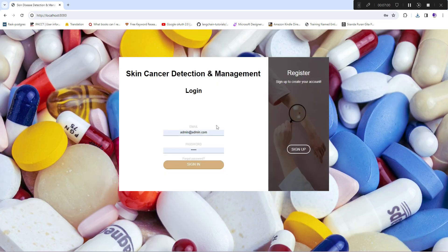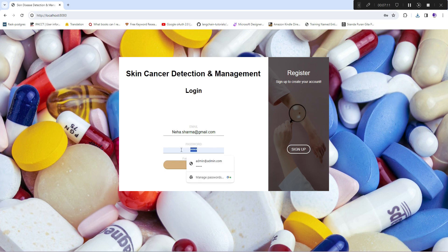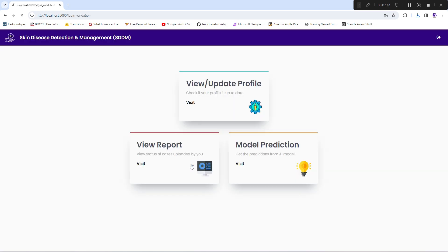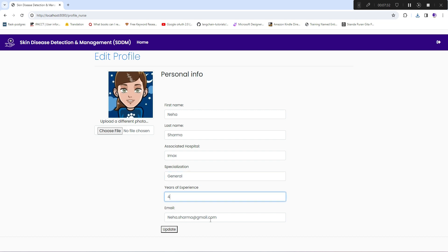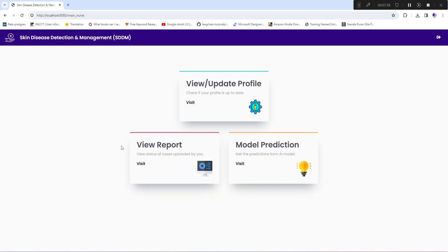Now we'll look at the nurse view. We have a nurse named Neha Sharma — all synthetic data just to illustrate the interface. When the nurse logs in, she has three options: update her profile (uploading her image, hospital affiliation, specialization, years of experience, and email), view report, and model prediction.